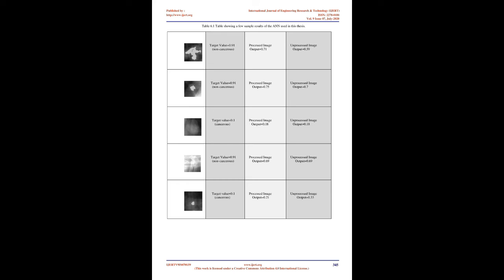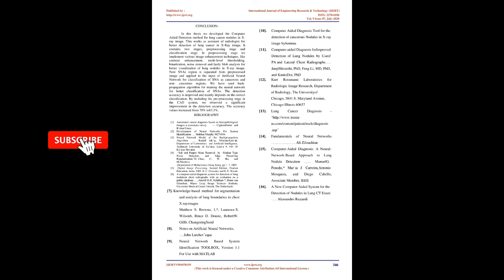Method 1. In this method we calculate the area of each blob and obtain a circle with radius r and area equal to that blob. This circle acts as a template to locate the round objects. After that we obtain the boundary coordinates of each blob. For each boundary coordinate, say p, of each blob, we center a circle with radius r at p and calculate the following ratio value. Ratio equals area of intersect of circle and blob over area of circle and blob.